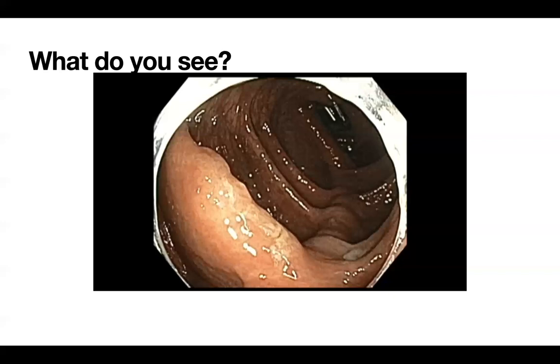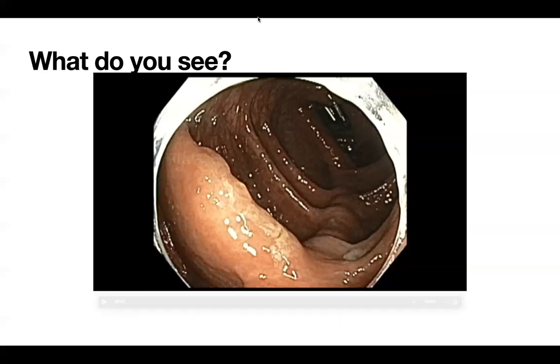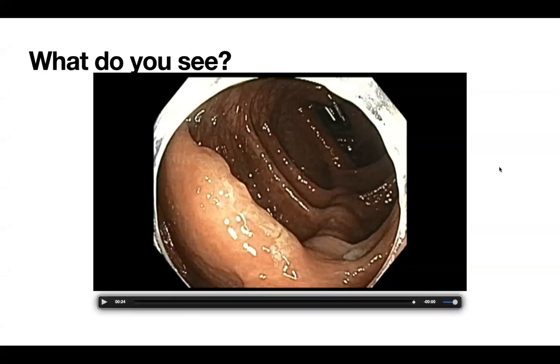Whereas there are other situations where the mucus is so adherent that you cannot clean it properly. That truly requires a second prep, a second 2-day prep, and then doing the procedure again. That is what makes me decide whether I would like to clean and look for other polyps, or I would just say that this needs to be done a second time.